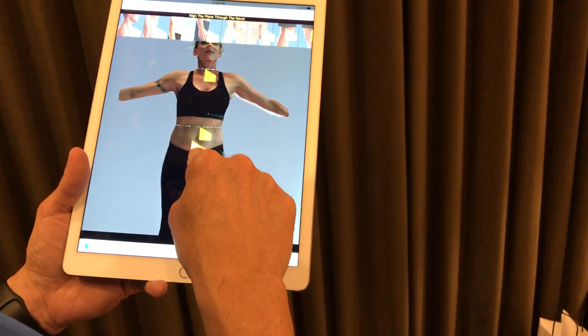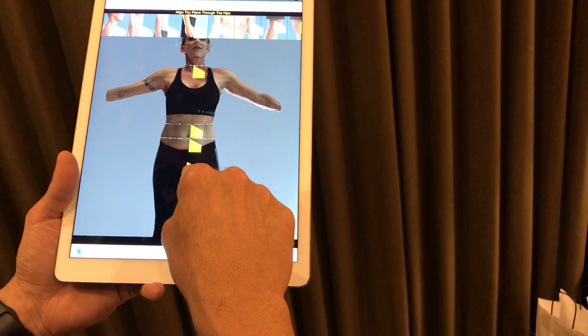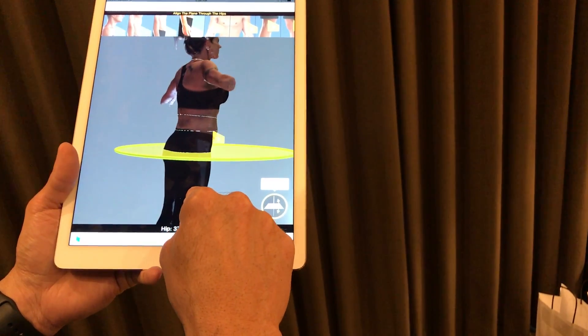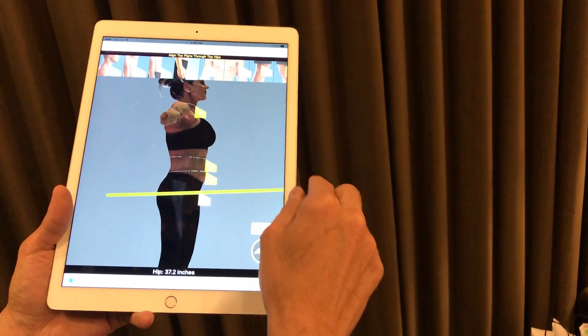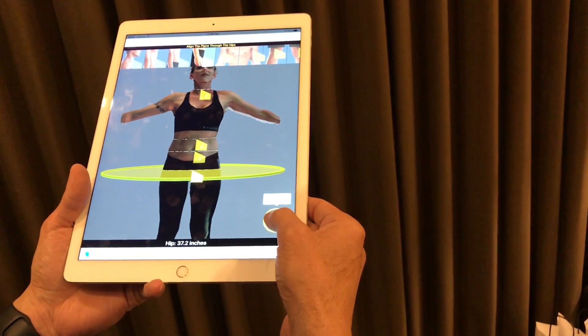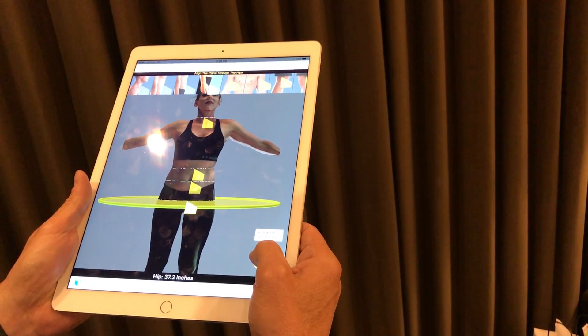I'm going to come in here, click on the belly button, and then we're going to click on the pelvis and hips. You want to technically have the widest portion here. So if I do this and tilt — that looks pretty good at 37 inches — I can probably tilt that a little bit more. Again, this is up to your discretion. I'm just going to tilt that just a little bit more.